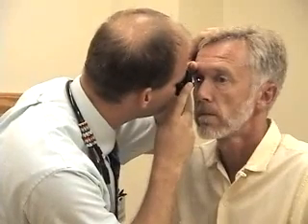And I'm going to trace the vessels back towards the disc, and then trace them out all 4 quadrants. Now just look at the light just for a minute. Okay. And I then do the same thing with the other eye.